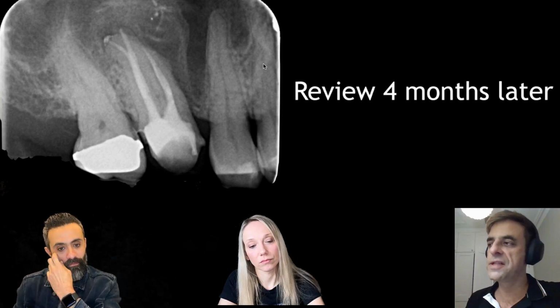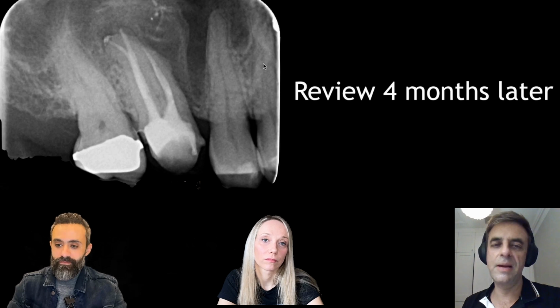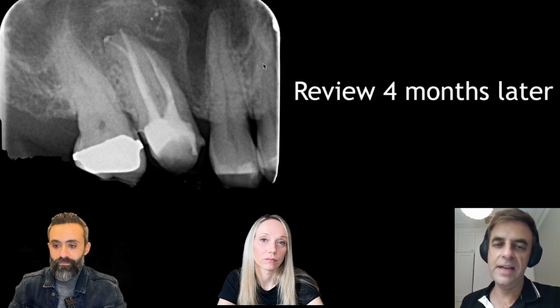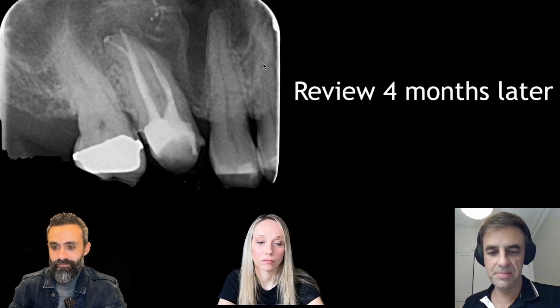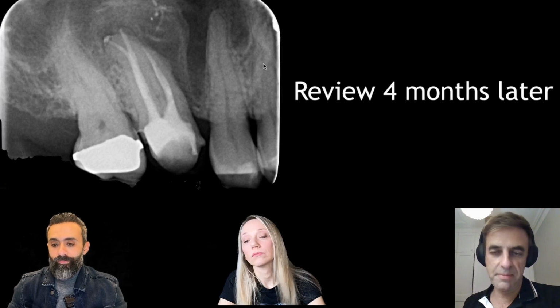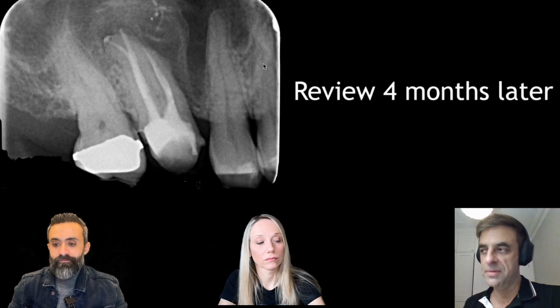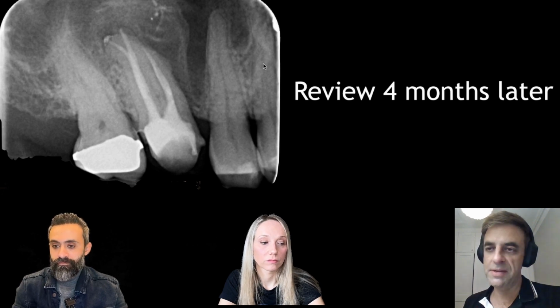So we're always looking. I often say to dentists, we don't really see a canal definitely all the time on these scans, because, as you know from taking 2D radiographs, a file that's size 10 or less is very difficult to see the tip on a radiograph. And it's the same on a CBCT. I mean, a CBCT is just a 3D radiograph. And so the same for the canal. It's well documented in papers that if the tip of the instrument is small, you won't see it as well as some instruments. Obviously, when it gets to a certain size, you'll see it.